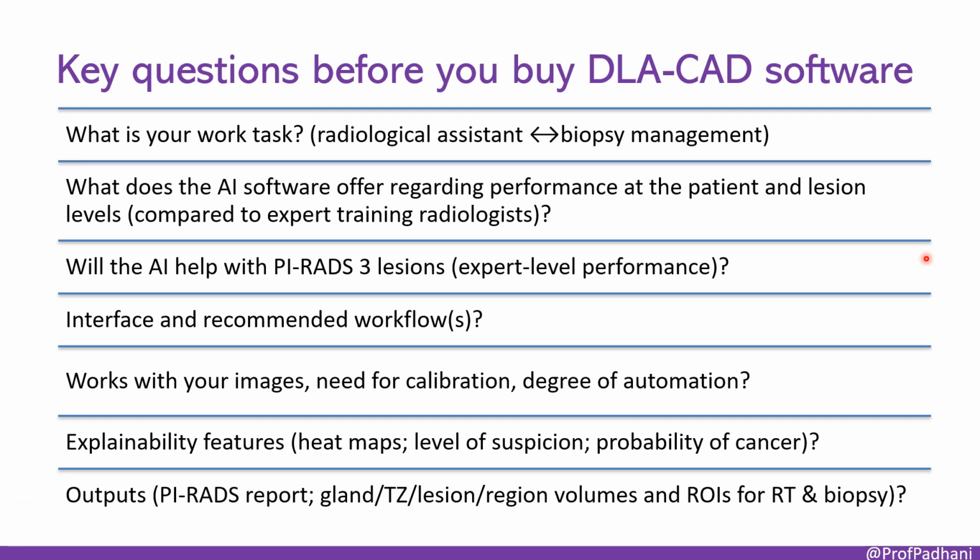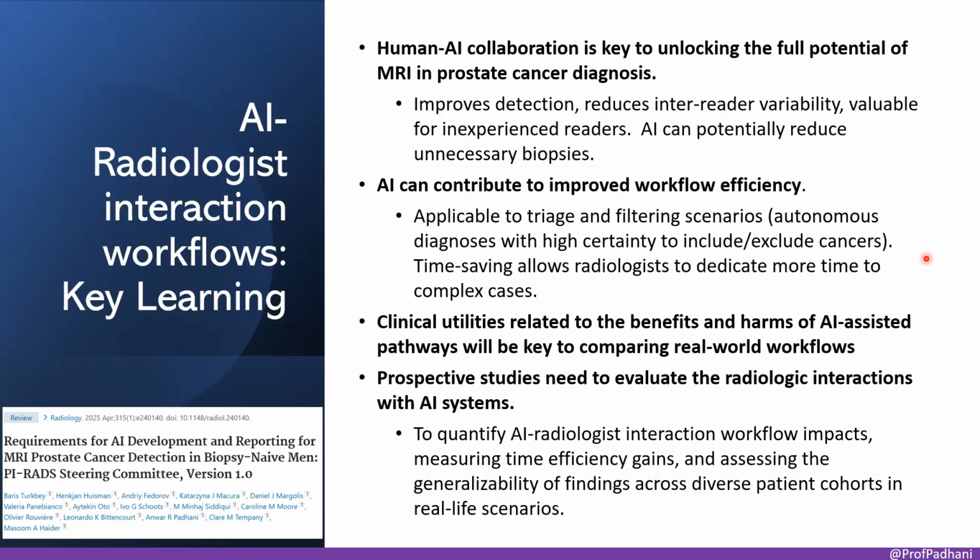Yeah. Okay, finally, slide 38 summarized the key learning points about these AI-radiologist interaction workflows. What were the main takeaways for you from the whole presentation? I think the biggest overarching theme is that human-AI collaboration seems to be the most effective path forward right now. It's not about replacement, it's about assistance. Collaboration, not replacement. Exactly. AI definitely shows potential to improve detection rates, maybe reduce that troublesome inter-reader variability we see, and potentially, hopefully, lead to fewer unnecessary biopsies, especially for those PI-RADS 3s.